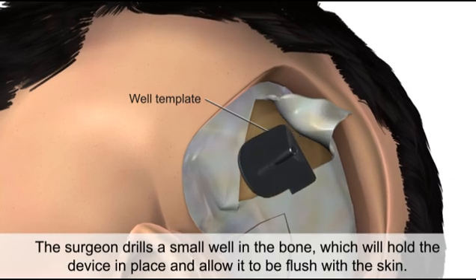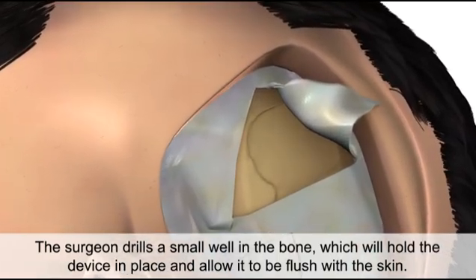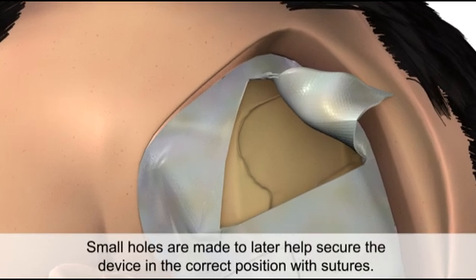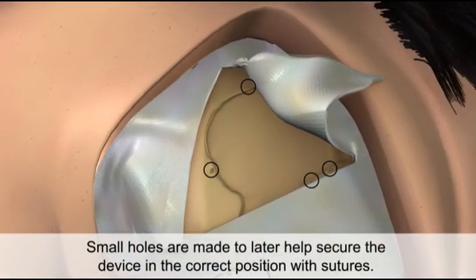The surgeon drills a small well in the bone which will hold the device in place and allow it to be flush with the skin. Small holes are made to later help secure the device in a correct position with sutures.